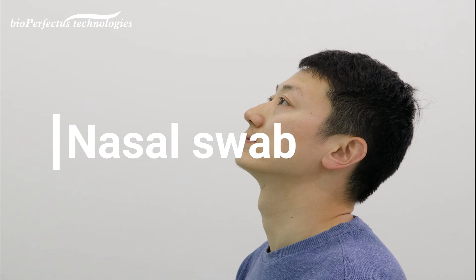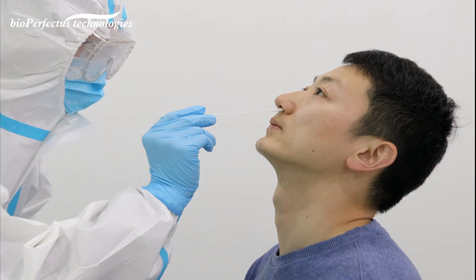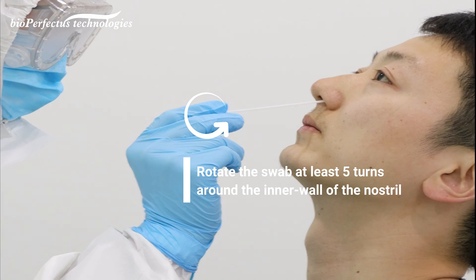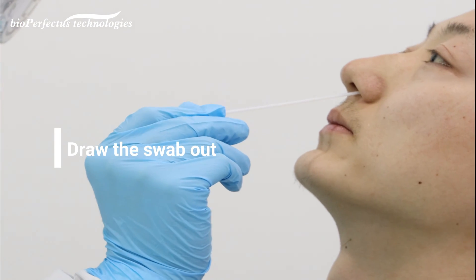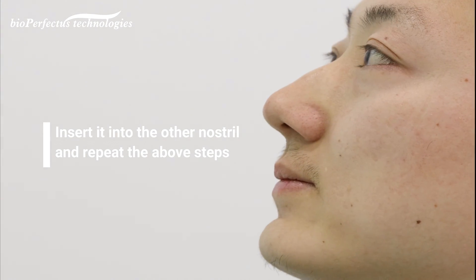Nasal swab: Insert the swab into one nostril by approximately three-quarters inch deep. Rotate the swab at least five turns around the inner wall of the nostril. Draw the swab out, insert it into the other nostril, and repeat the above steps.